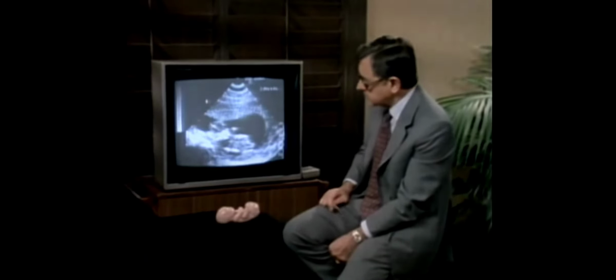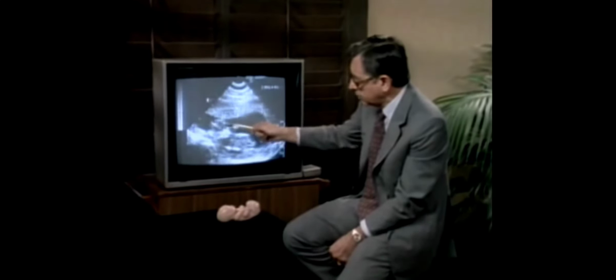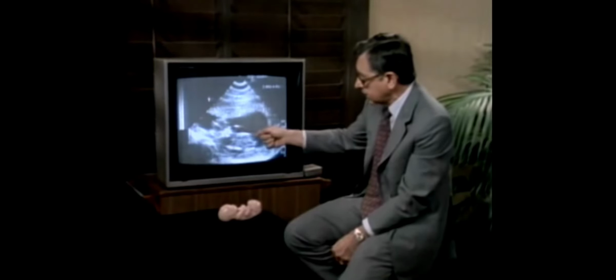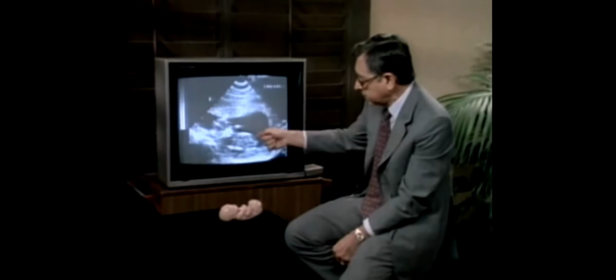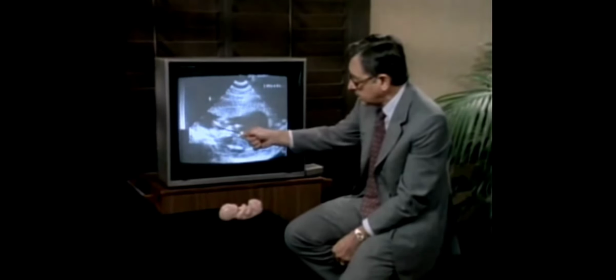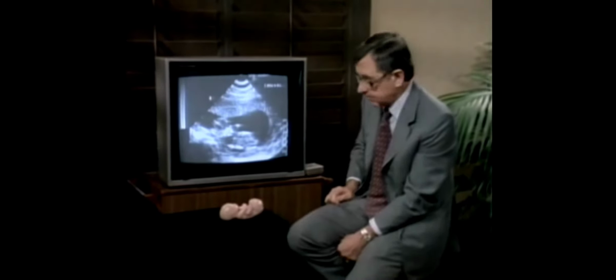Looking a little more closely at the child, we can discern the eye, or the orbit of the eye, here, the nose of the child here, the mouth of the child here, and we can even look at the ventricle of the brain here. This is a fluid-filled space in the brain.